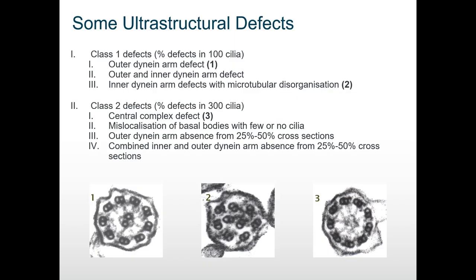Here are some of the more common ultrastructural defects seen in patients with PCD. In picture one, we have an absence of outer dynein arms — there's an empty space where the dynein arm should be, and in a patient with this defect the cilia wouldn't move properly, perhaps moving a little but not to their full extent. In picture two, we have inner dynein arm defect with microtubular disorganisation — it has completely lost its nine-plus-two structure and the inner dynein arms are missing from the microtubules.